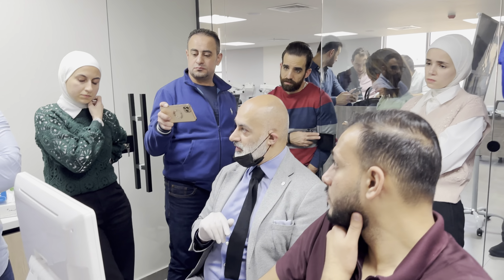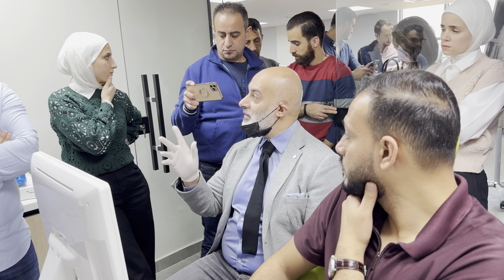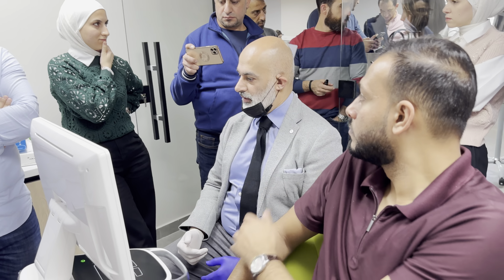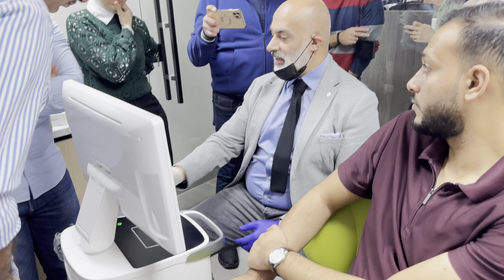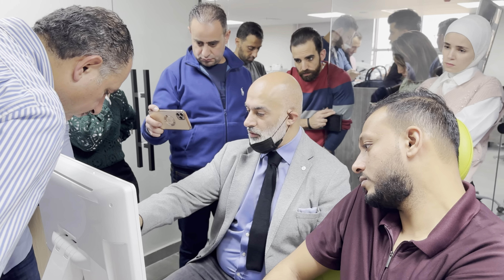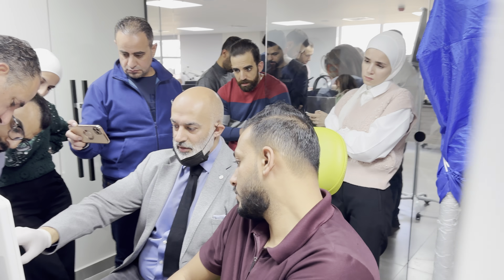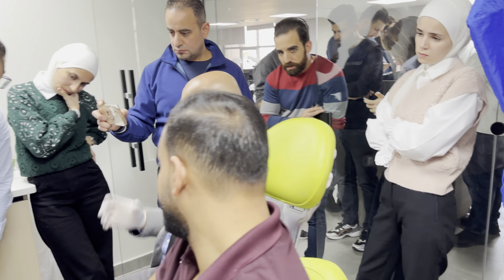In the articulation it will show some lateral movement, and I will explain lateral movement and its problems when we talk more. But what this will show you is that I can go to the articulation stage. This is the upper model — did you notice that the contacts have changed? Yes, they're different now.